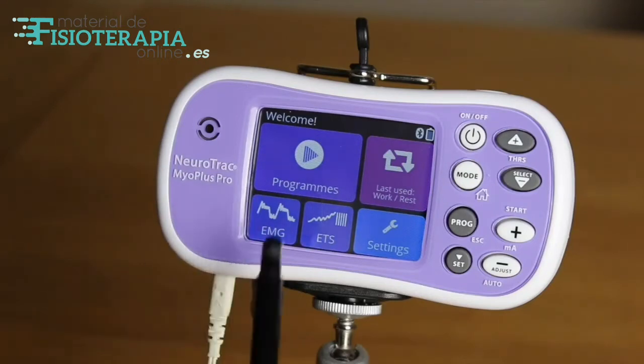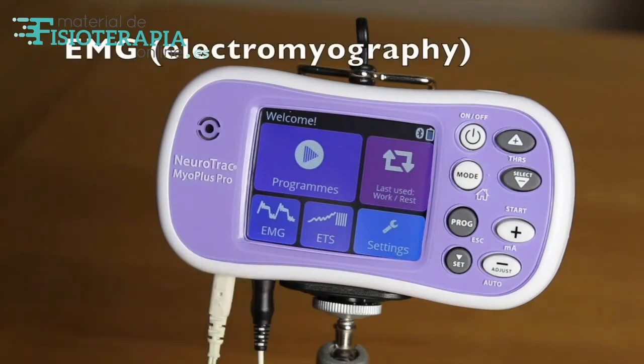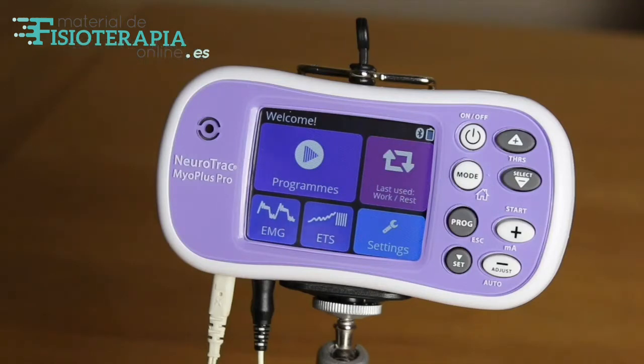Let's look at the second function of the MyoPlus Pro and how it can monitor performance using EMG — electromyography. This is a form of biofeedback giving precise measurements of muscle activity.